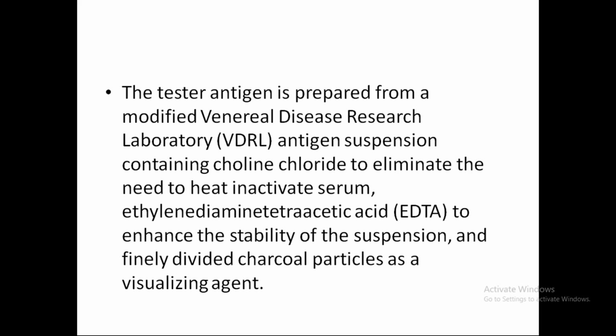Principle. What is the principle of the RPR test?